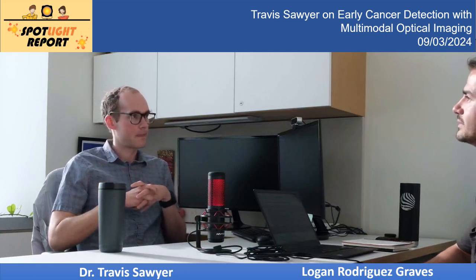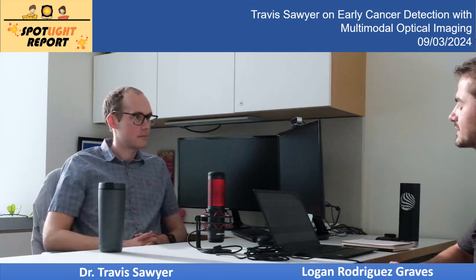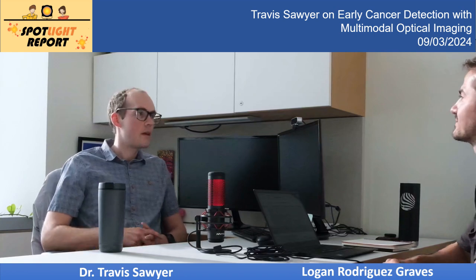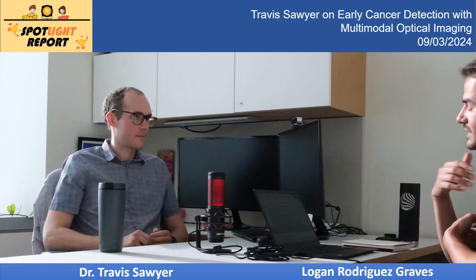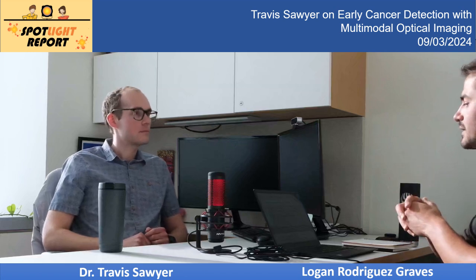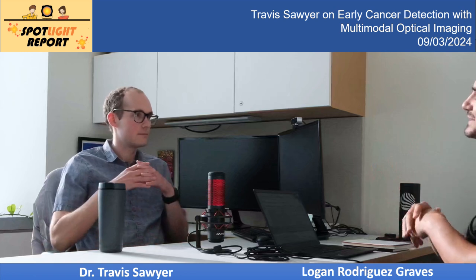And we will certainly get into the modalities of how these optical systems are put together, but I feel like for the audience, the motivation for them being small should be pretty obvious, right? If esophageal, it's going down your throat, they're imaging something in your esophagus, ovarian, other modality, but anything that's going to go inside your body, you want as small as possible.